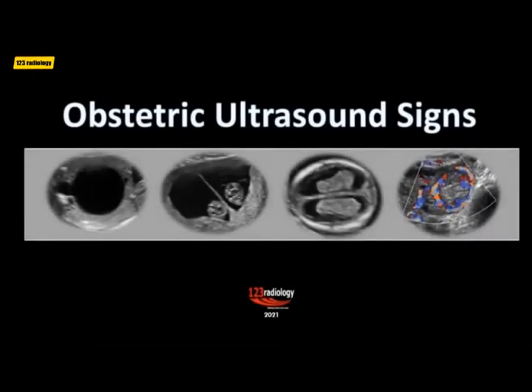Welcome to this lecture. In this lecture, I will discuss important obstetric ultrasound signs. So let's start.